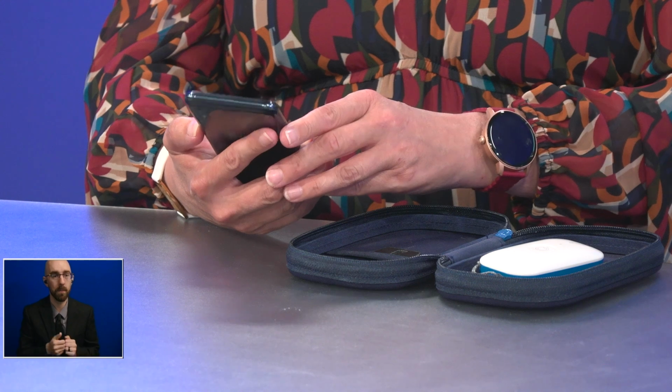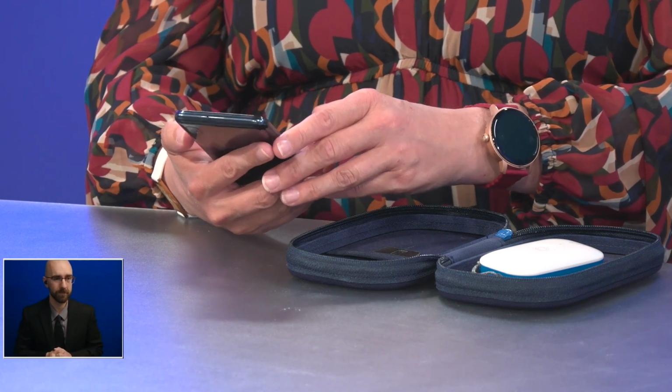And Amy, you have a show and tell for us on your phone? Oh, yes. How does that work? The DBS is with the Medtronic system, and this is to activate it, turn it on. And then with my phone, there we go. Well, this morning it wants to take its time. So what are you able to do on the phone?